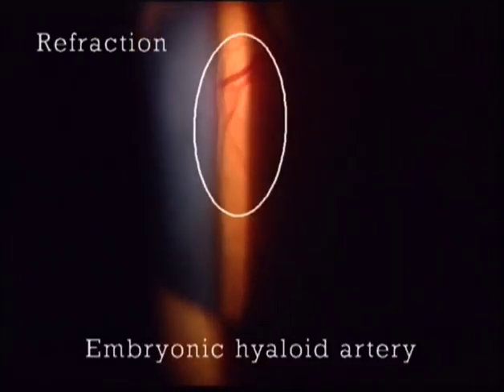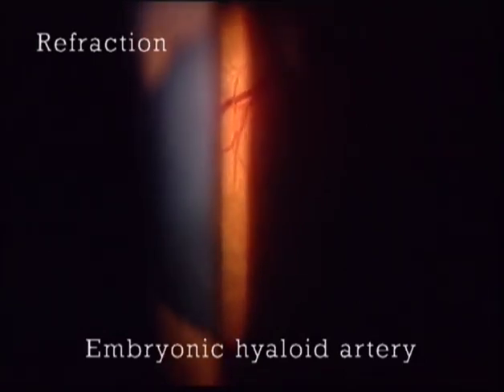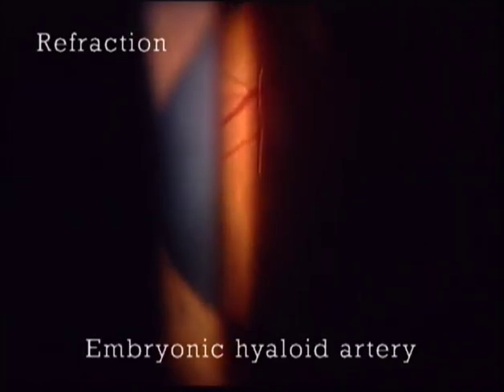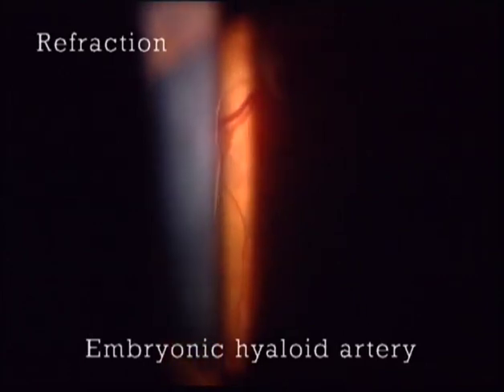To the contrary, refracting phenomena look different when the shape or color of the background changes, or when their distance from the background varies. For example, this clinically irrelevant remnant of the embryonic hyaloid artery floating in the vitreous is transparent and refracting. When the floater moves, its margins remain dark, in contrast to absorbing objects. The position of the dark side varies depending on the position of the object to the backlight. Here, the dark margins are seen at the right side of the floater, and here at the left.